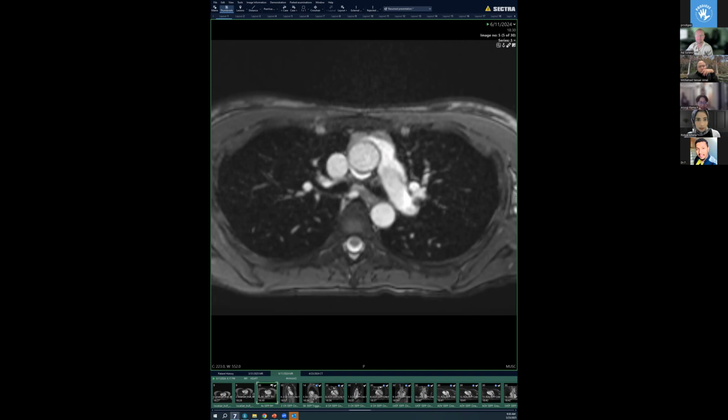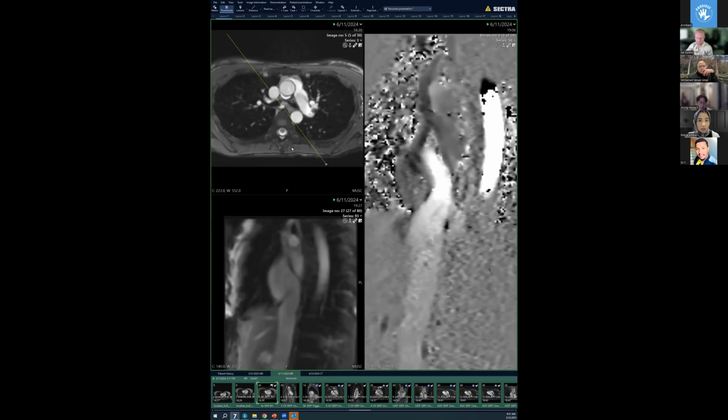Prof, I would like to confirm, in the measurement of mitral valve prolapse, do we need to only report the prolapse qualitatively, or is there any objective measurement that we need to report for these findings? Yes, like I showed you, the measurement of the annulus level and the maximum prolapse of whichever leaflet that is. It's also important to report if you can identify whether it's the anterior leaflet or the posterior leaflet or both leaflets, and measure it.